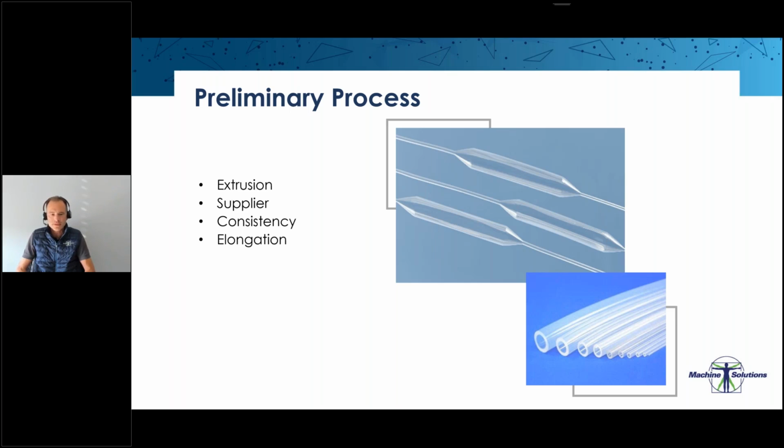It's a key ingredient. So we need a good supplier, a supplier that can deliver on a consistent basis, consistent quality, and a supplier that allows us to make quick adjustments to the extrusion during the development phase. Because we know a change of supplier is difficult. Again, consistency. Quality, good and long-term supply with consistent material characteristics, and quality is key to produce high quality balloons.